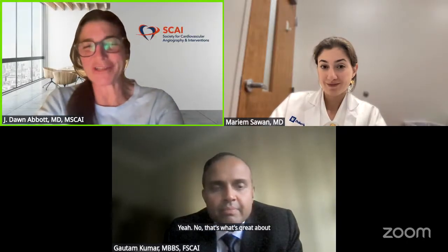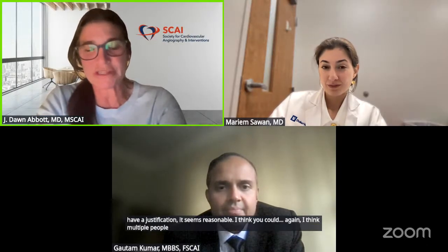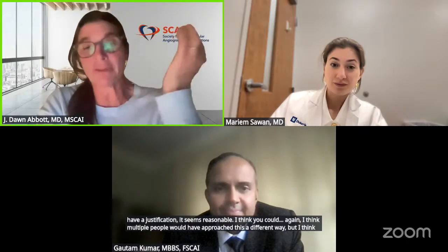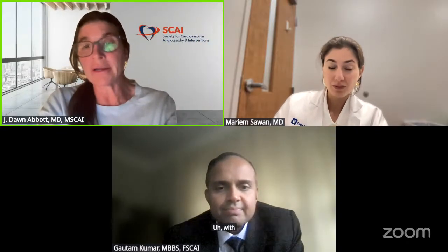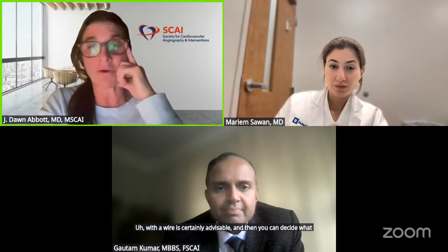Yeah, that's what's great about interventional cardiology. As long as you have a justification, it seems reasonable. I think multiple people would have approached this a different way, but securing the vessels with a wire is certainly advisable, and then you can decide what the priority is.